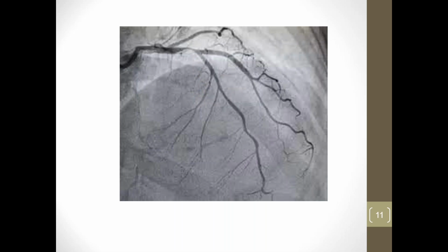Here's an actual X-ray image of the coronary arteries. So here's your left artery, your circumflex. I believe this is your LAD right here. So like I said, this is what the cardiologist would be looking at on his screen. And I can see why they'd use a 12-inch CRT monitor to look at this stuff, because those coronary arteries are really small and some of them are hard to read.